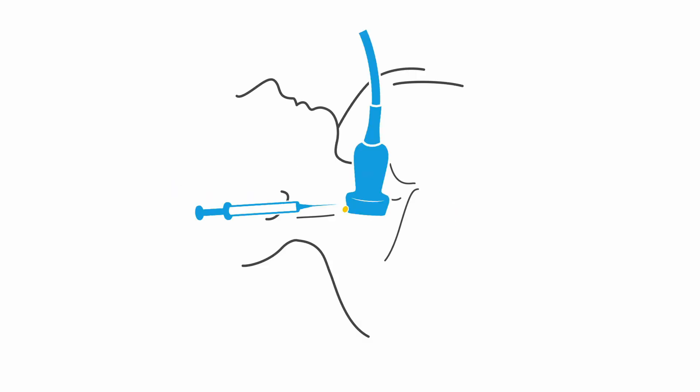Here is general probe placement for longitudinal or sagittal axis. The vessels here will appear as tubes. The probe should be perpendicular to the skin and the indicator towards the head.